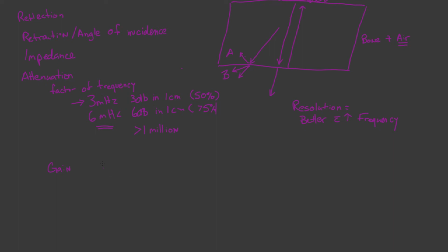So as you send out a beam of ultrasound, and we're going to call this time down here, your probe sends it out, generates a signal, and then the signal continues to propagate through the body, hits another structure here before it gets reflected back to the machine.